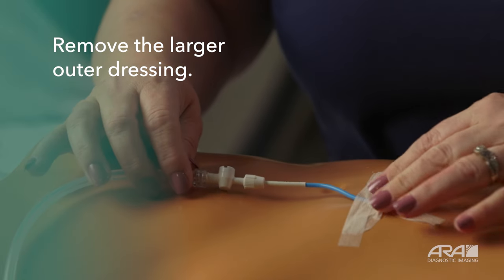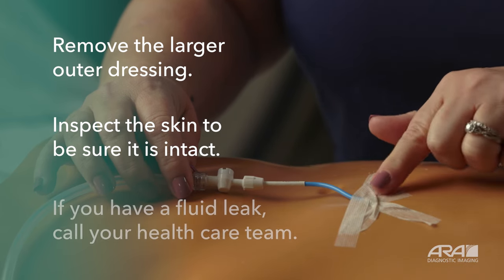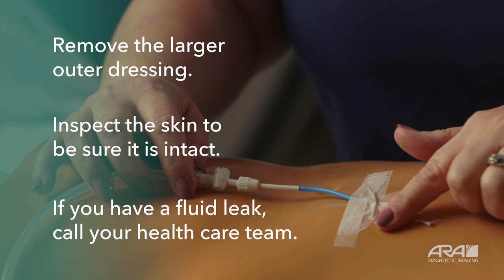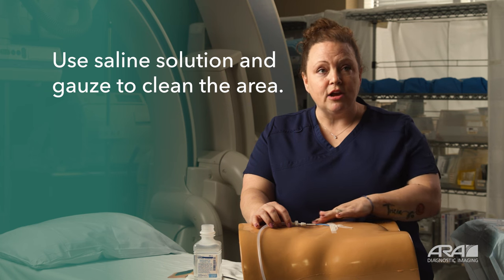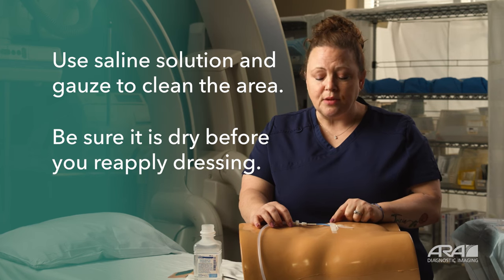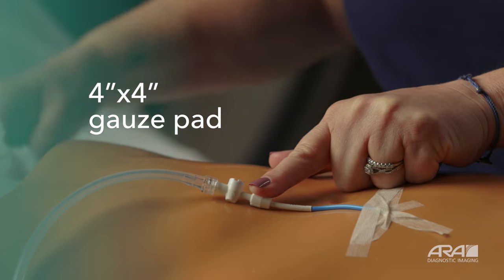Once the drain is free and clear of the dressing, inspect your skin around the drain access point. If you have fluid leaking from the drain, you'll need to contact your doctor's office. Inspect the skin to make sure it is intact. You can use saline and gauze to clean the area as needed, keeping in mind that saline and gauze will not remove the adhesive — the adhesive may stay with you for just a little while. When you're ready, take your supplies.